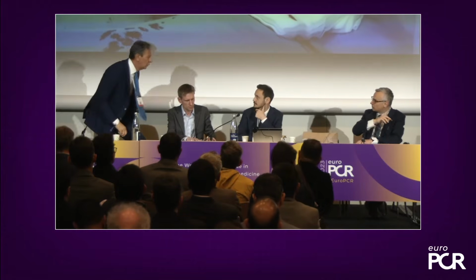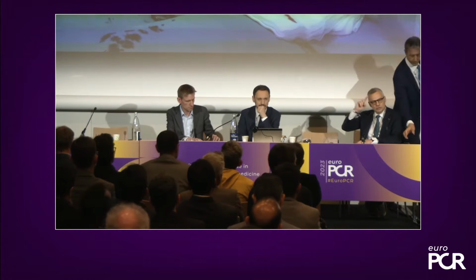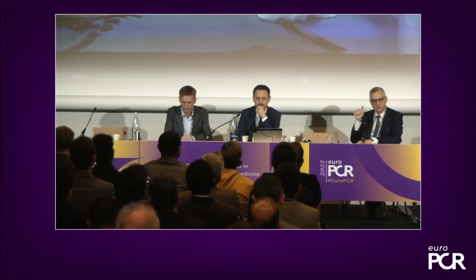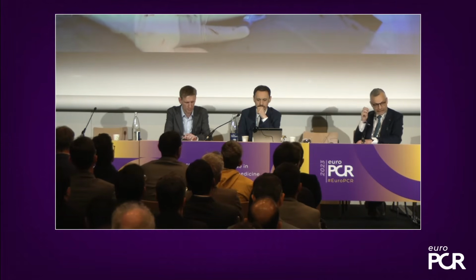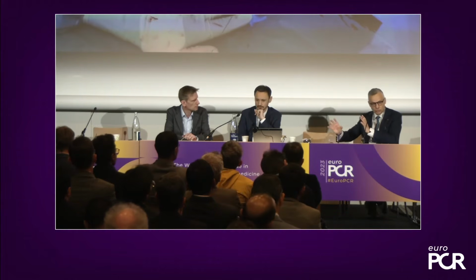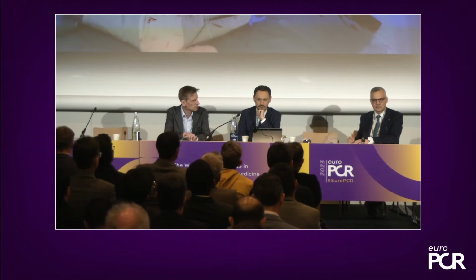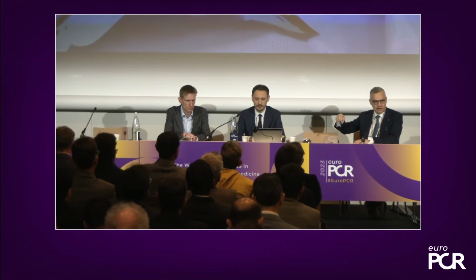Maybe, Sergio, you can elaborate a little bit on the smart screen on how to do echo-guided puncture. But keep in mind, in my opinion, two messages already from Ole De Backer. Number one, watch the CT scan and plan. CT scan is fundamental for planning, understanding where to go, what to do, the location of the bifurcation. And then the second one is go where you planned. And that is by echo.